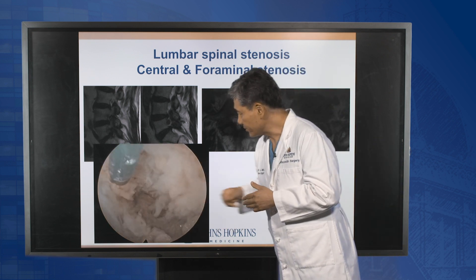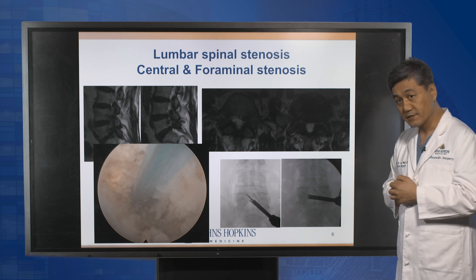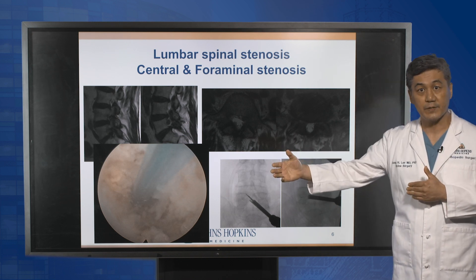This is the nerve root on the other side. These are the intraoperative x-rays, showing that we can access the other side of the spine very nicely.